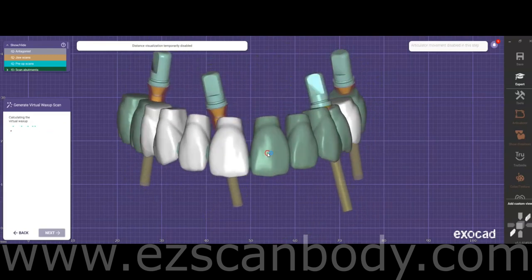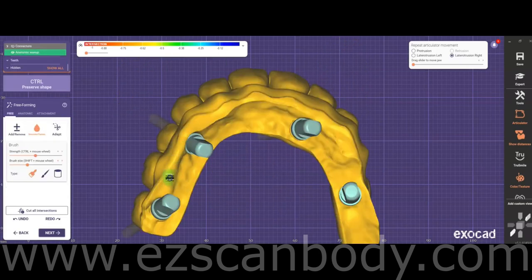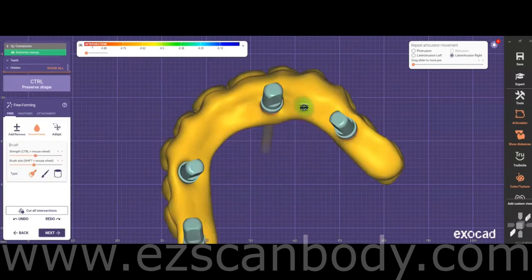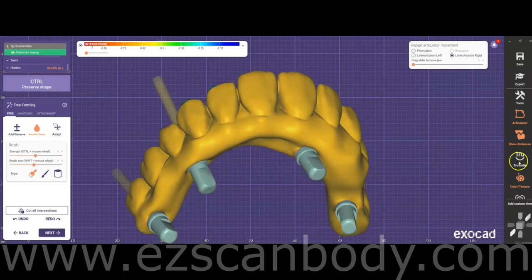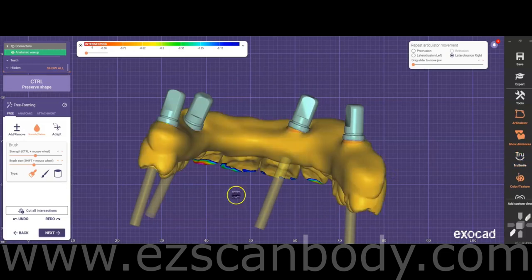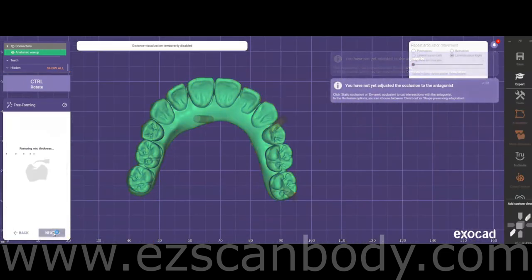After generating the virtual wax-up scan, proceed to the final freeform stage. Ensure the intaglio surface is as narrow as possible, with all borders rounded and free of any bumps underneath. Verify that the areas around the screw holes have sufficient thickness to maintain the appliance's strength. For all-on-X cases, it's recommended that clinicians level the bone and gum during surgery and perform adequate bone reduction to achieve optimal prosthetic outcomes. After merging, the file is ready for milling or 3D printing.